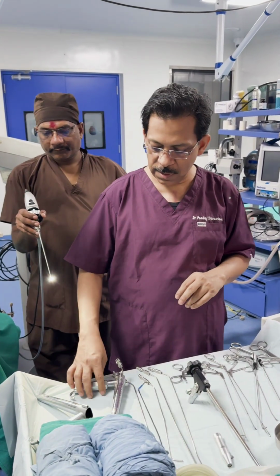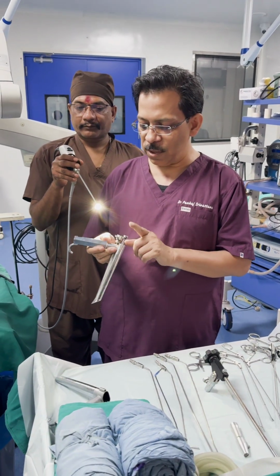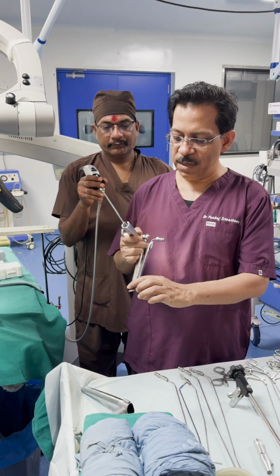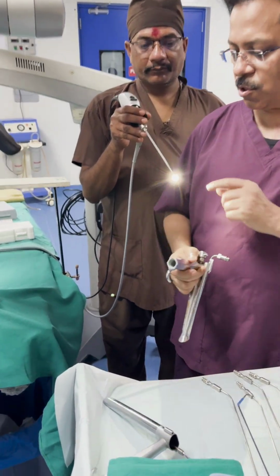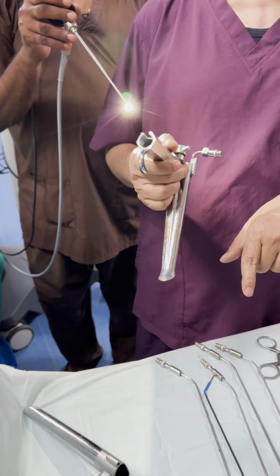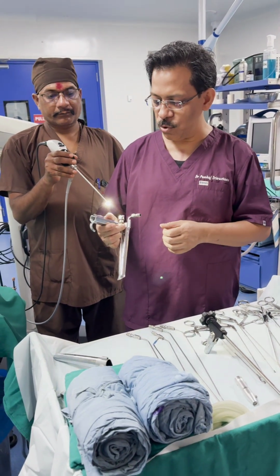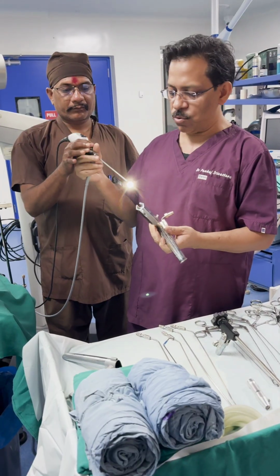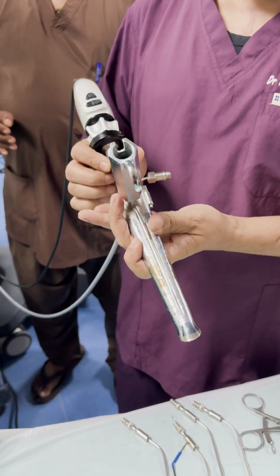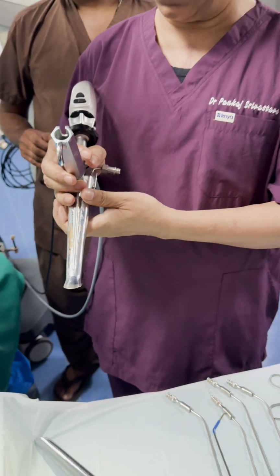Now what is the next option if the lesion is not visible or anteriorly placed? So we have this endoscopic laryngoscope. In this there is a tilt anteriorly, and even the 0 degree, which is wide angle, is able to see all around very well. So there is no need for a 30 degree or 45 degree endoscope. So when we attach the 0 degree endoscope in this laryngoscope and lock this, vision is improved instantaneously.